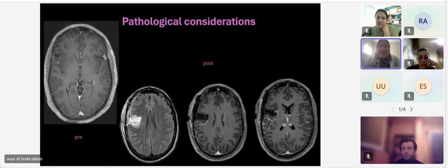Okay, quickly, I will review some images for pre-treatment and post-treatment. For example, this patient has some enhancement here, and we catch a lesion here. You can see also there is some gyral thickening, and they took out this mass, whatever it is, and I wanted to show you some post-surgical changes, how it looks, what the expectation is for this.